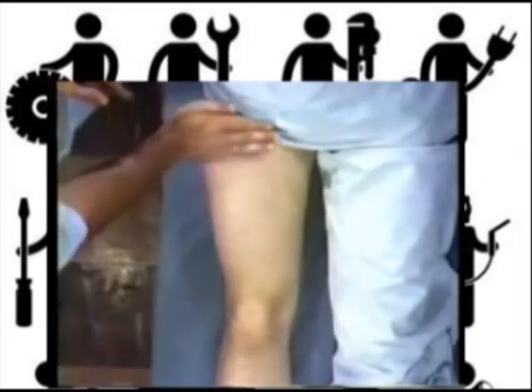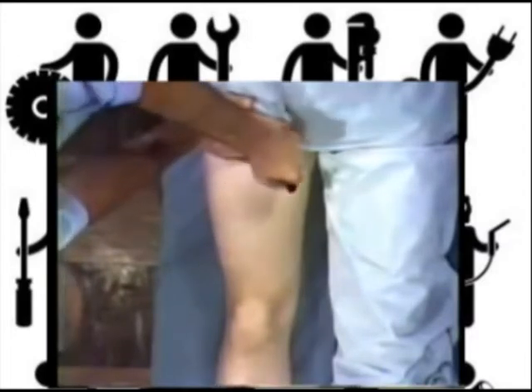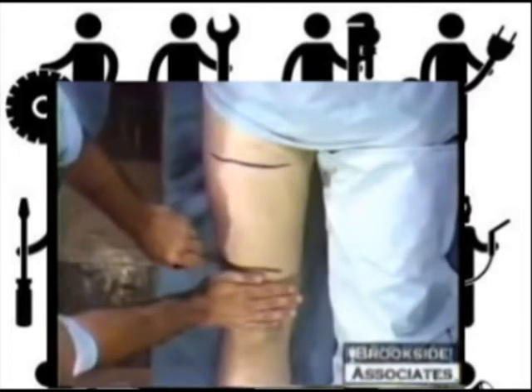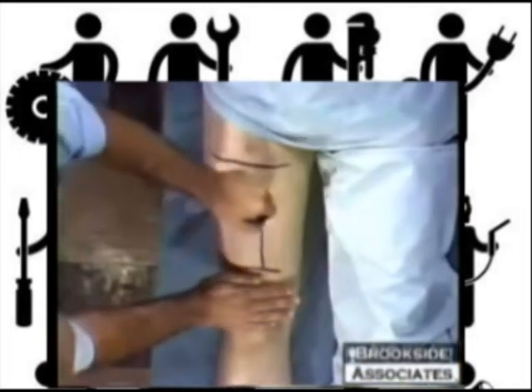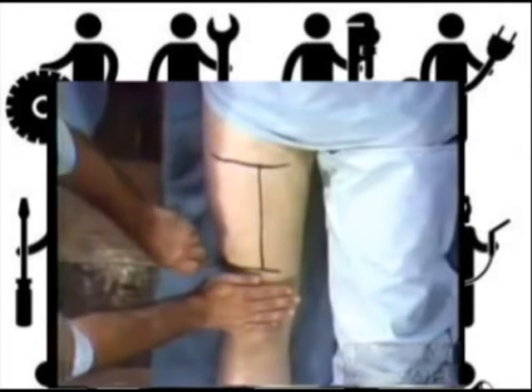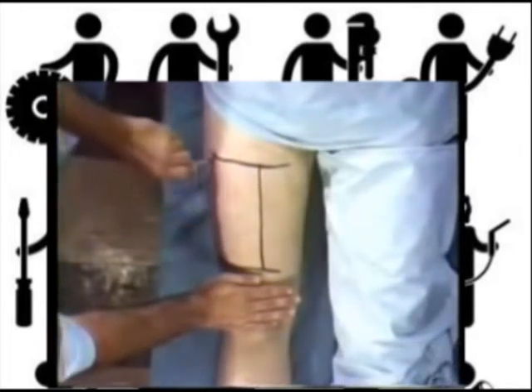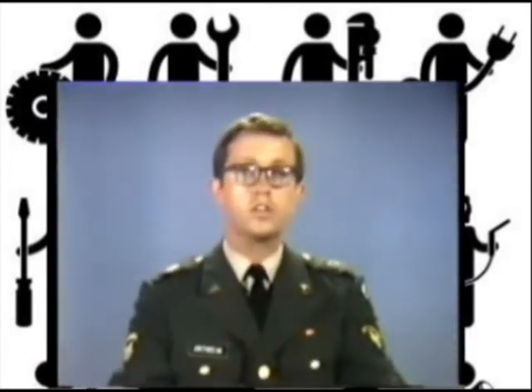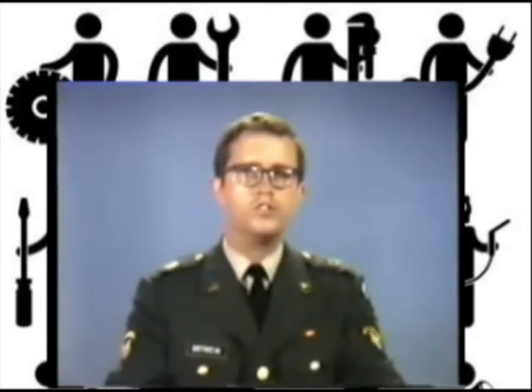Once again, a hand's breadth below the groin and a hand's breadth above the knee. The side boundaries are from the mid-anterior thigh to the mid-lateral thigh. Now that you know the most common sites, watch closely while the intramuscular injection is administered several times using different types of syringes and needles and the three sites we've discussed. First, using a reusable needle and syringe in the deltoid region.